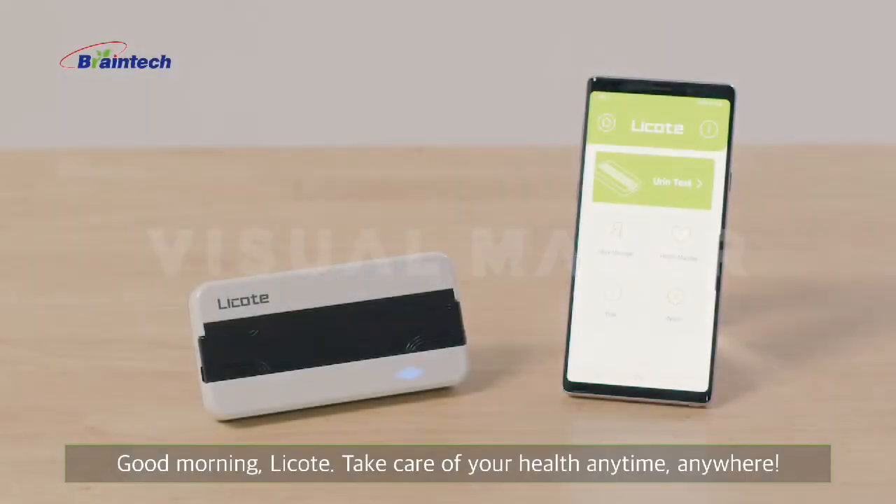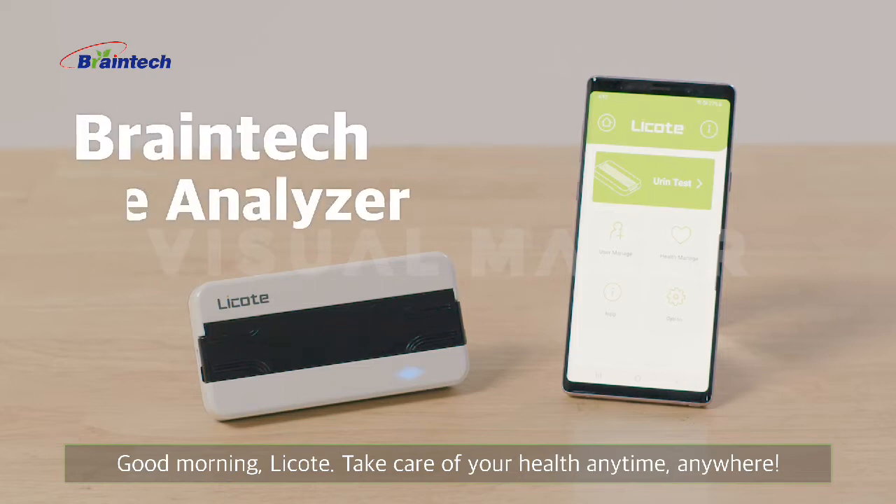Good morning, Licote. Take care of your health anytime, anywhere. Braintech Urine Analyzer.